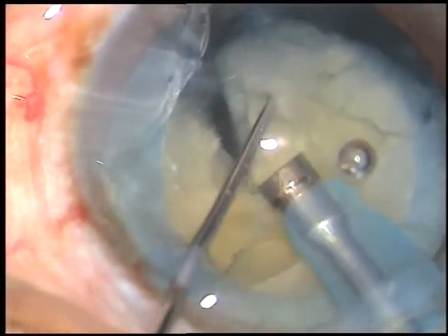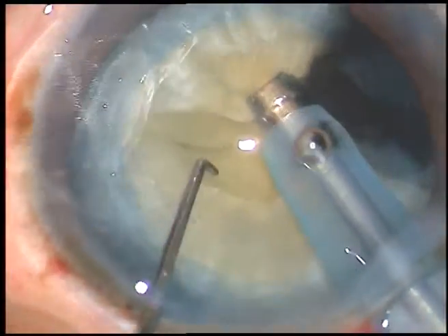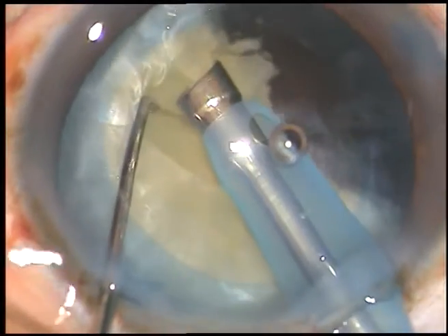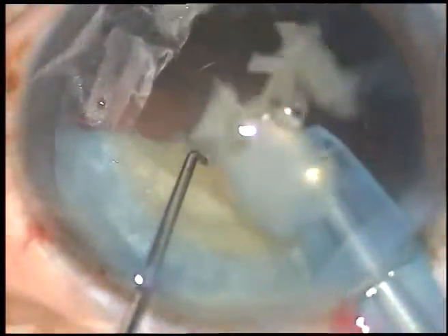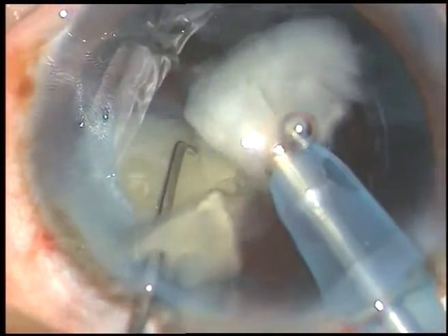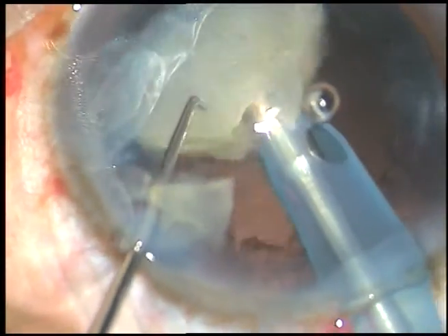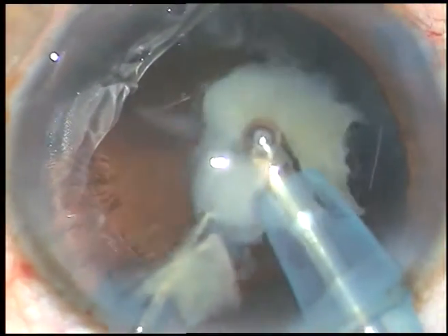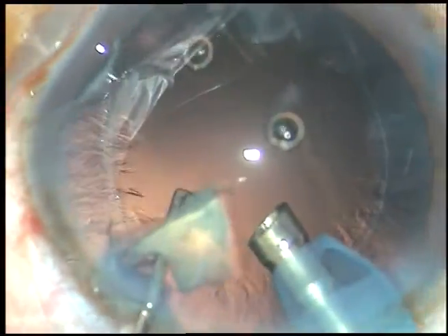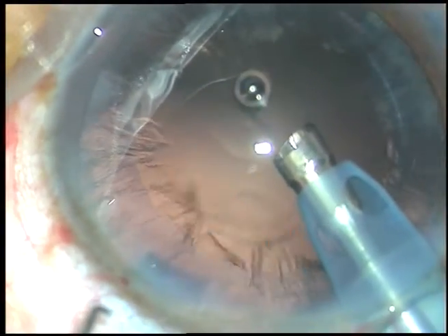Hold it at another place and chop. This free nuclear fragment is emulsified and removed. Ultrasonic energy used in this case is 60%, flow rate is 45 ml per minute, and vacuum is 450 mmHg. This is the other hemi-nucleus — it is held, chopped, and removed. Now, this fragment which is very near to the side port through which the chopper has been introduced needs to be brought to the center and then chopped and removed.